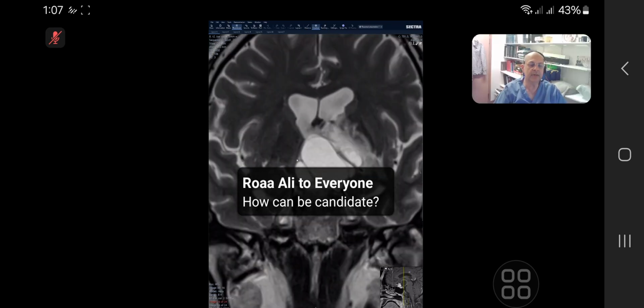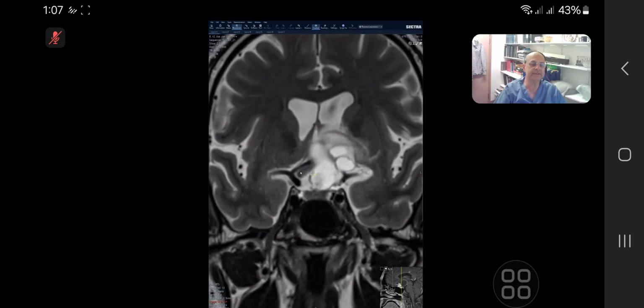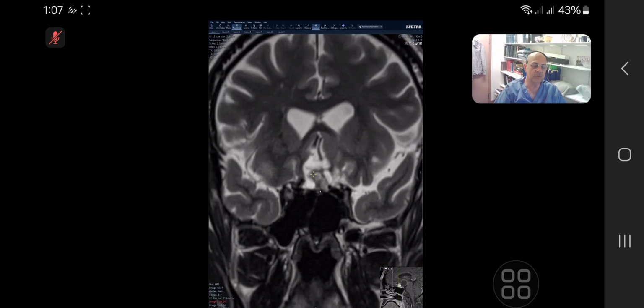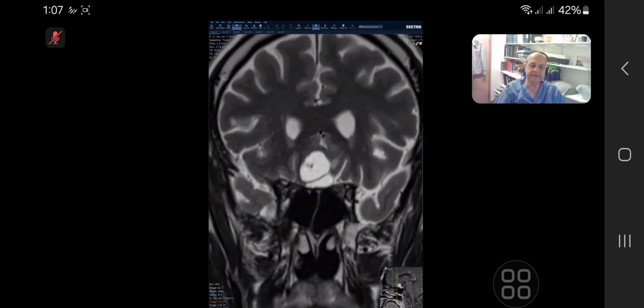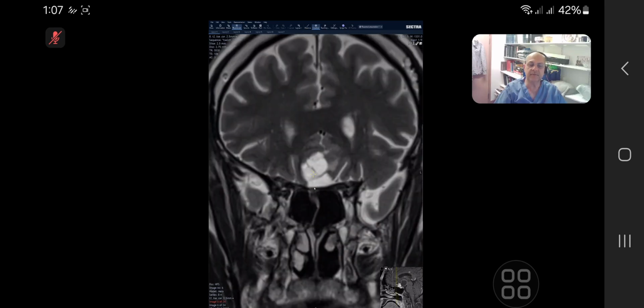So it's a craniopharyngioma. But to the examiner, in your description, when you have separated the optic chiasm, you will say, I've separated the optic chiasm, so it is not arising from the optic chiasm. Since the epicenter is in the floor of the third ventricle, suprasellar, and it only touches the planum, and it is cystic with some solid component, this does not have a primary feature of a meningioma. So see how in my description I am touching the differential but negating it as well. That I've thought about it, but I do not think it is.